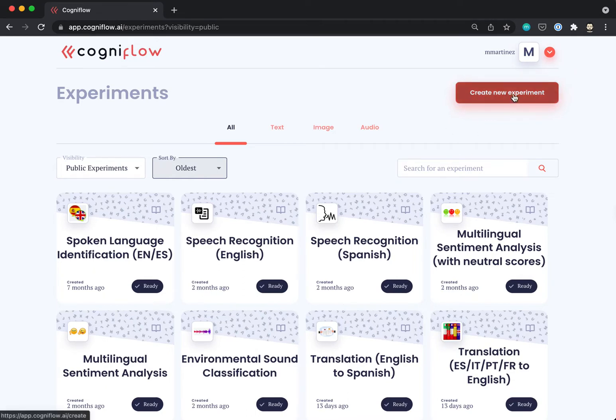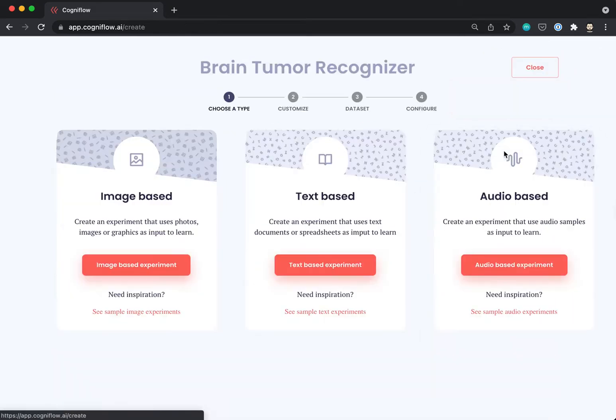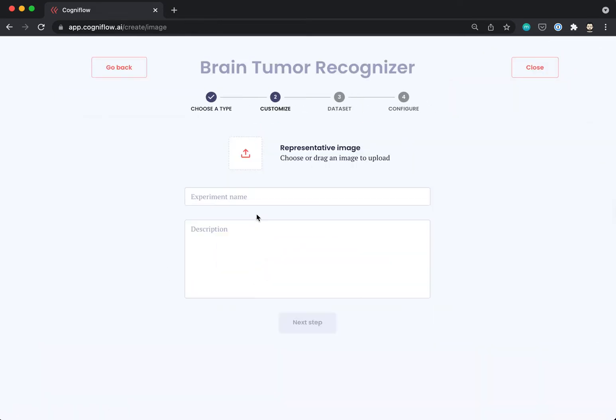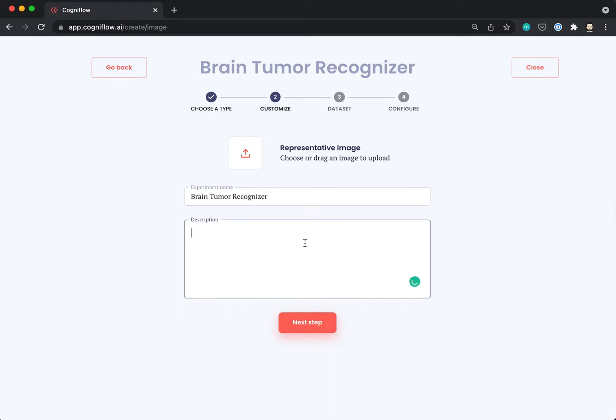First, we need to create a new experiment and then select an image-based type. At this step, we need to specify the experiment's name. In this case, it could be Brain Tumor Recognizer, and if we want, we can put a more detailed description and press next.